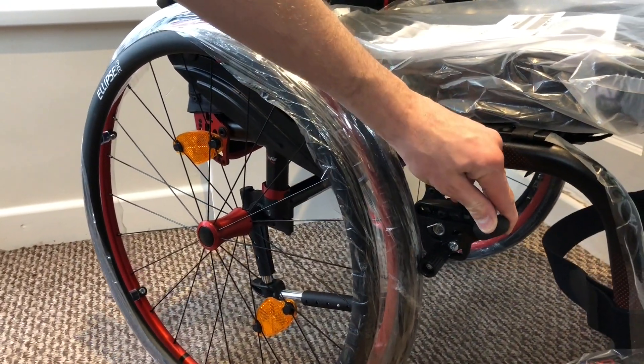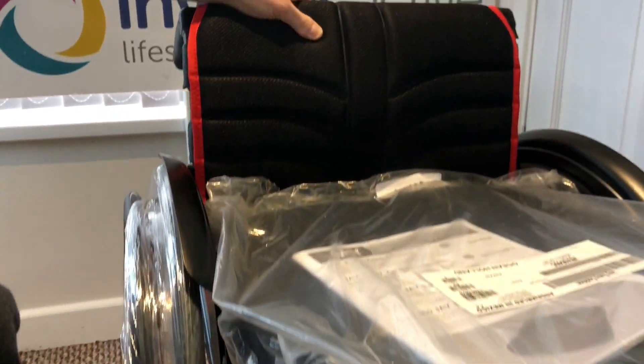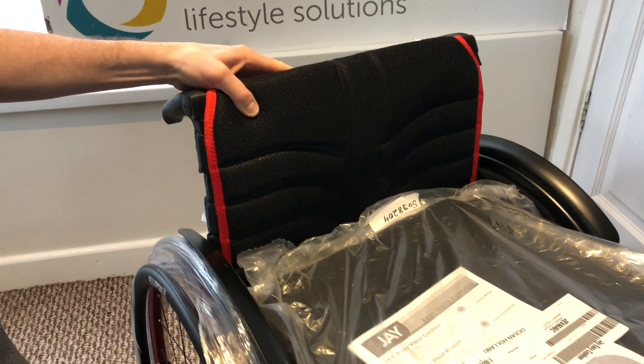These are the push-to-lock standard brakes. The backrest itself is the XO Pro.